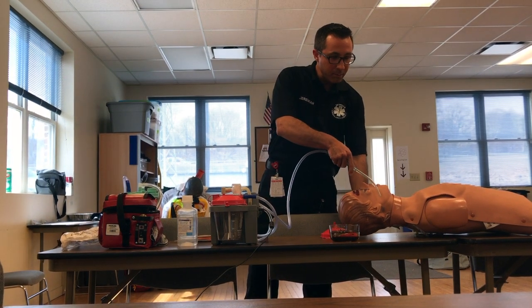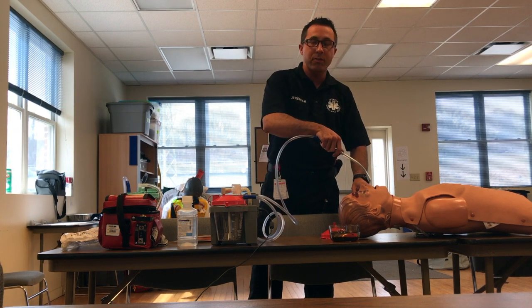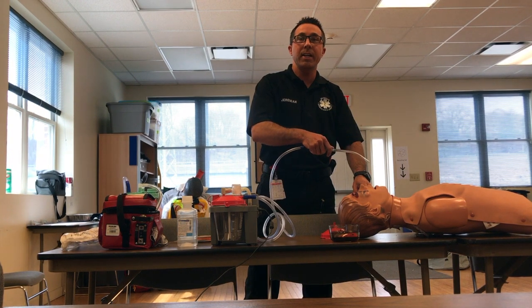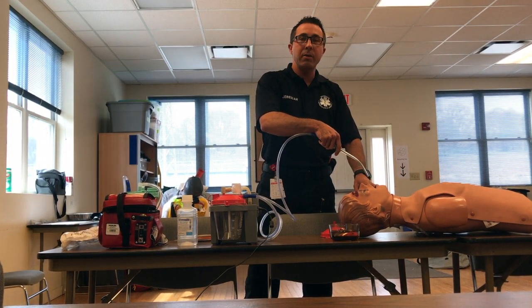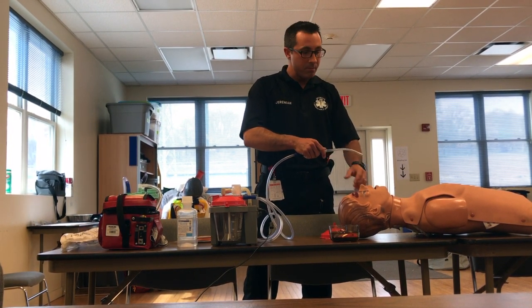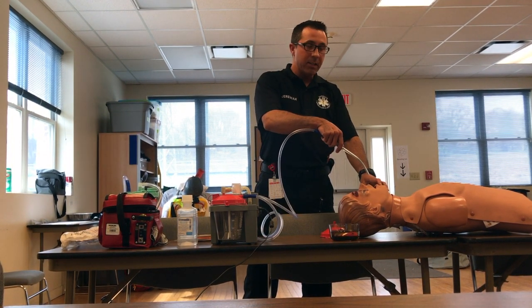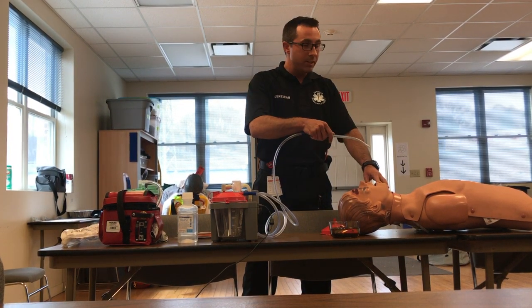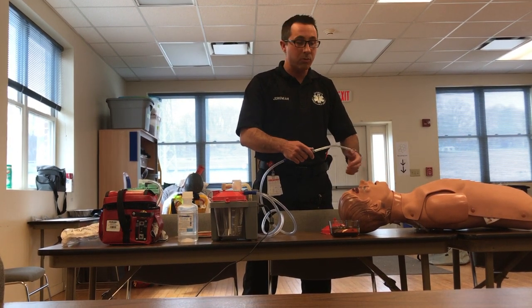Also, when you're suctioning, make sure you measure or at least verbalize that you're going to insert no further than you can see. If you suction too deeply, you can stimulate the vagus nerve, which is going to cause bradycardia — so suctioning too deep will drop the patient's heart rate. Lastly, you also don't want to stimulate the gag reflex, because inserting the suction catheter too deeply can cause the patient to vomit, which will make the situation worse.